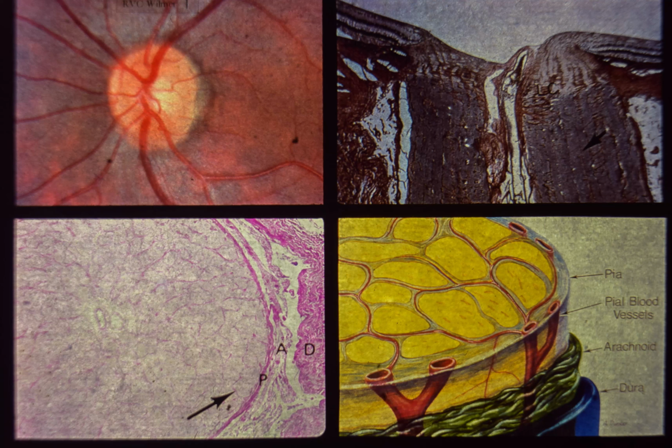Nerve fiber reflexes can be appreciated on the nasal side of the disc, but they are difficult to see on the temporal side because of the finer caliber of axons in the papillomacular bundle. Nevertheless, in a patient with a normal optic disc, the striations of the peripapillary retinal nerve fiber layer can be followed to the disc margin for 360 degrees.